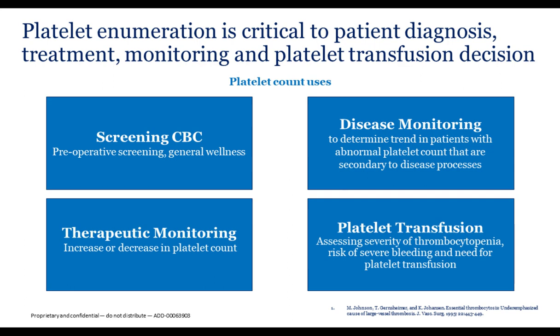So, when are platelet counts performed? As previously mentioned, screening CBC done routinely, again as a general wellness indicator, and also for preoperative screening. Disease monitoring to determine trend in patients with abnormal platelet counts that are secondary to disease process.